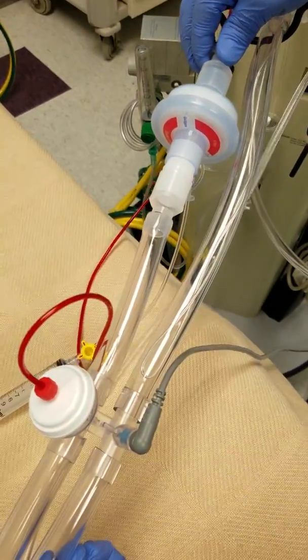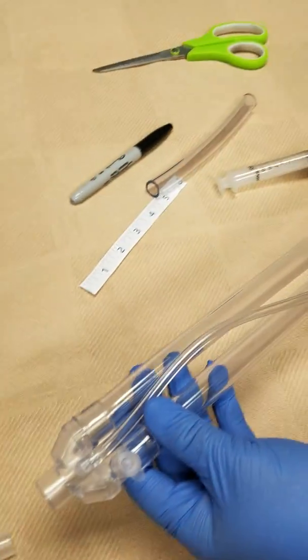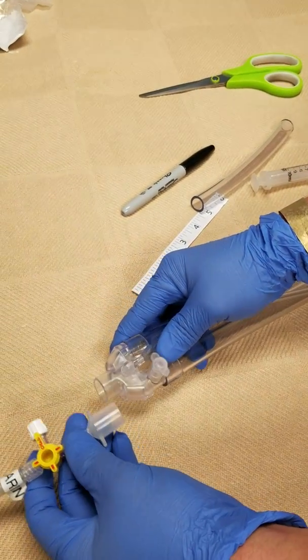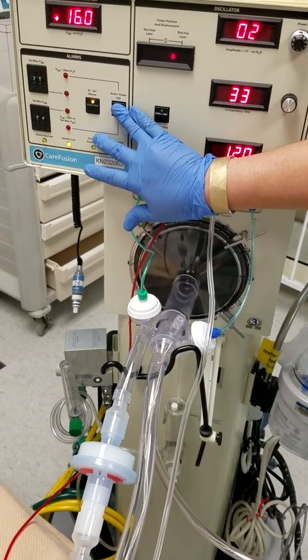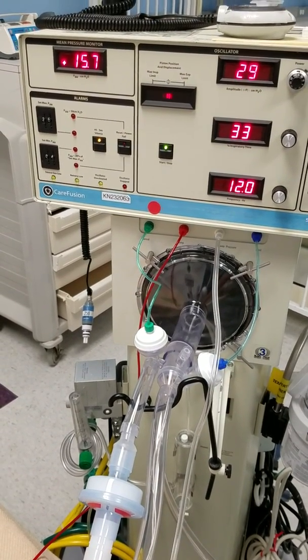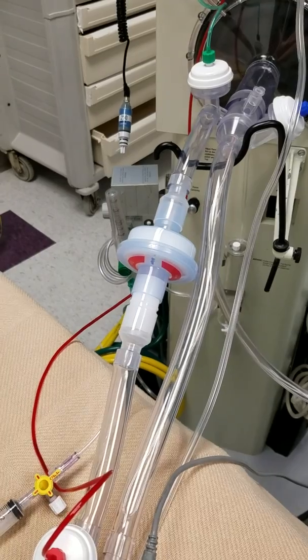That's how it looks. My stopcock is closed. When I'm ready to connect, I'm going to connect first, then come over here and get my flow back on. Pressurize the patient while the tube is still clamped, then start and unclamp the patient. This will be the safest way to avoid spraying any contamination, water, or aerosol that already contaminates the circuit.